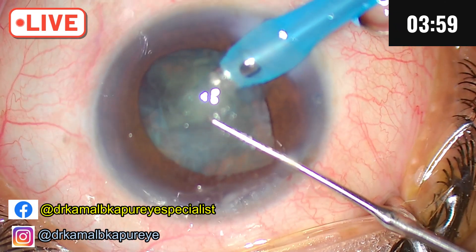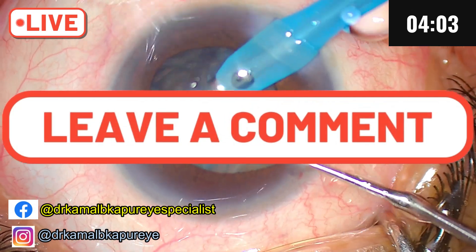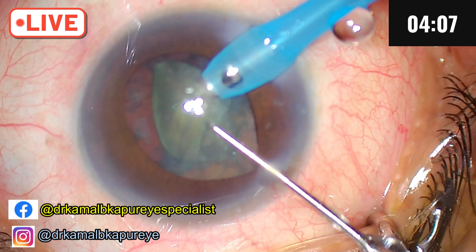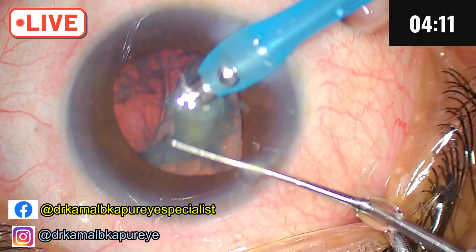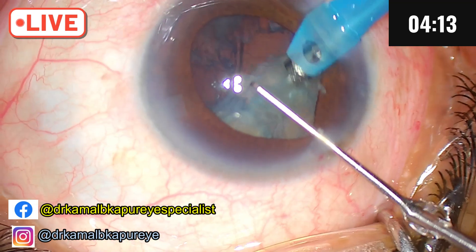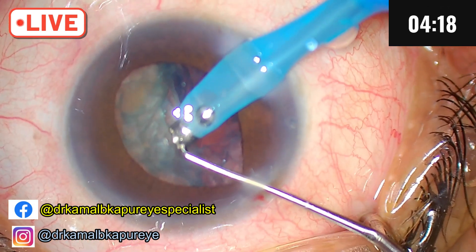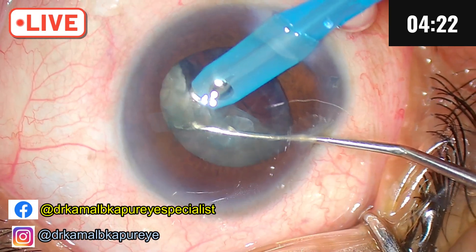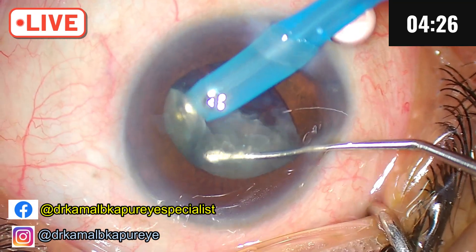I am going in steps. I will stop again — give a little burst, then stop. I don't want the intraocular pressure to be high for a long time. The fluid is off totally. I have an occlusion and I chop. I call this slow motion phaco.